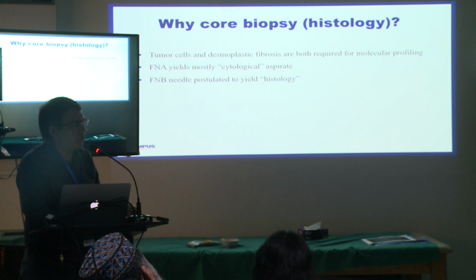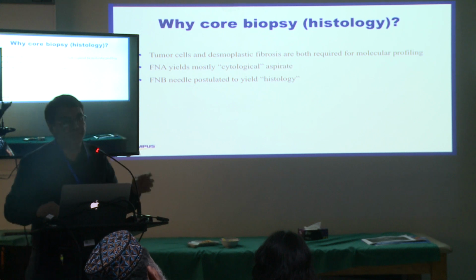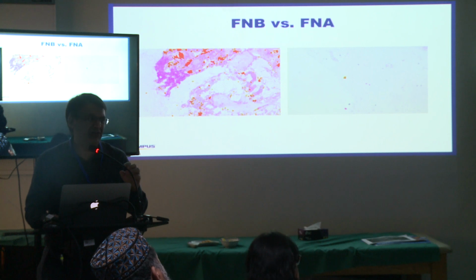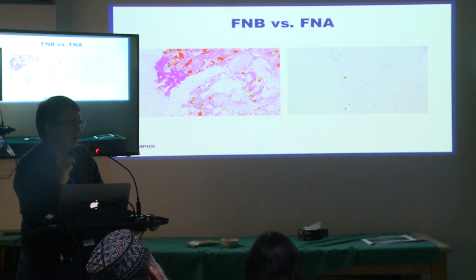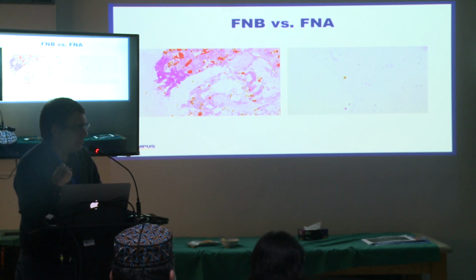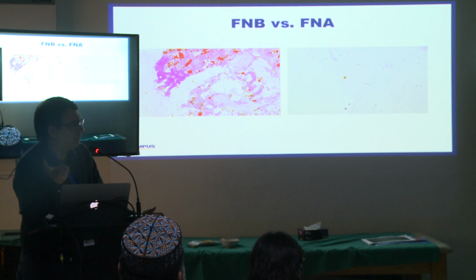Previously, when we didn't have an FNB needle, we were using a bigger 19 gauge needle to get some sort of core. Are you still using 19 gauge? No, I stopped using it. I only use it for interventions, really. For FNA, I don't even remember when was the last time I used it. Very interesting, you've never used 19. Honestly, I don't even remember the last time.